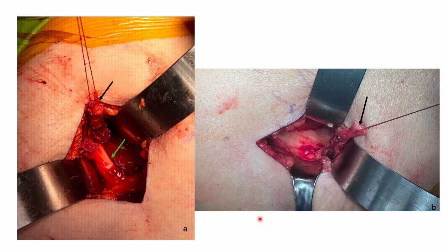I like to use bipolar electrocautery when removing these fibrovascular bands. Be sure to feel into the sciatic notch itself and palpate and make sure there isn't anything else that is laying over top of the sciatic nerve that needs to be released. You could have an accessory slip that you weren't aware of or a hidden fibrovascular band.